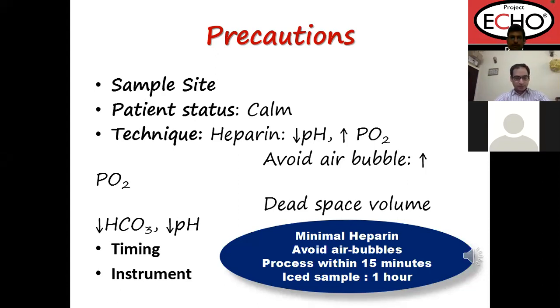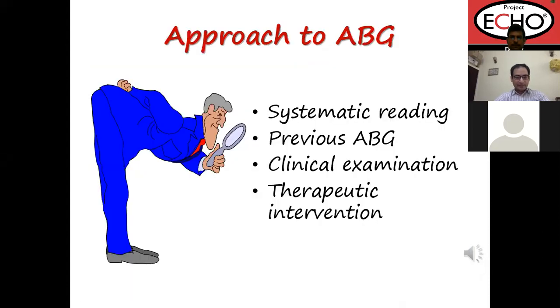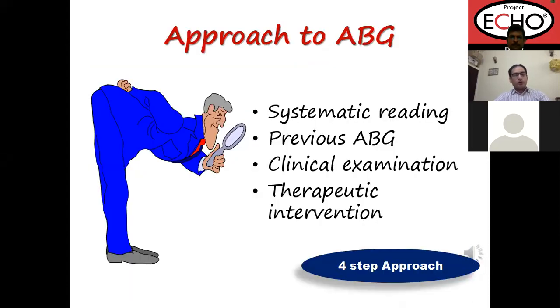Next slide. Next. So before interpreting, ABG should never be interpreted alone. You should know the previous blood gases. You should know your baby. You should know the clinical status. You should have any X-ray which is done, and other investigations like sepsis screen and others should always be available. So it is a complete entity. In blood gas, you have to treat the baby, not the blood gas. Go with the clinical picture. That is always rewarding.